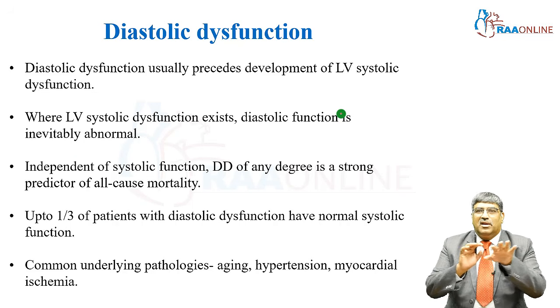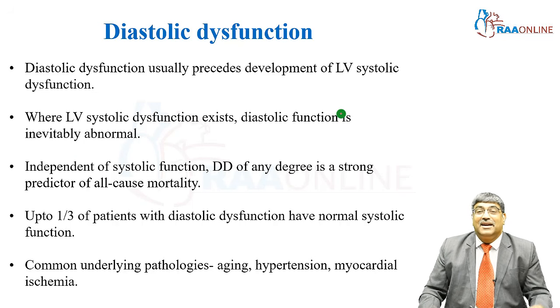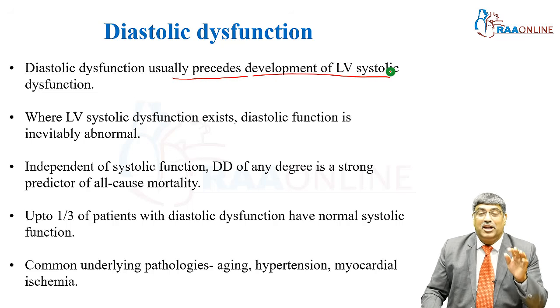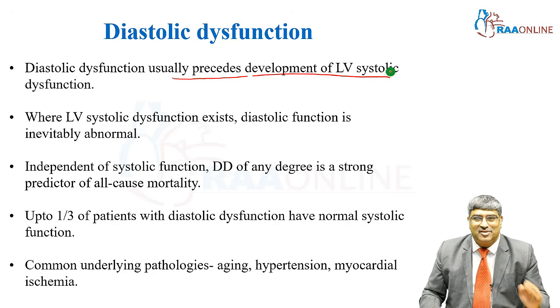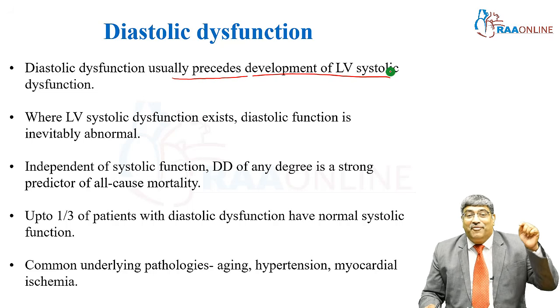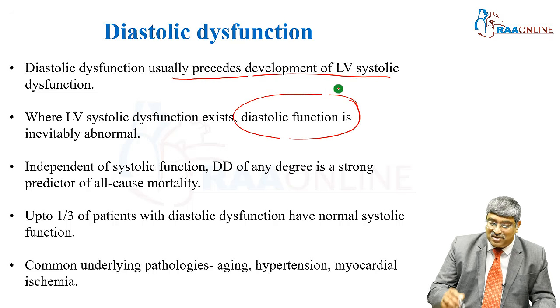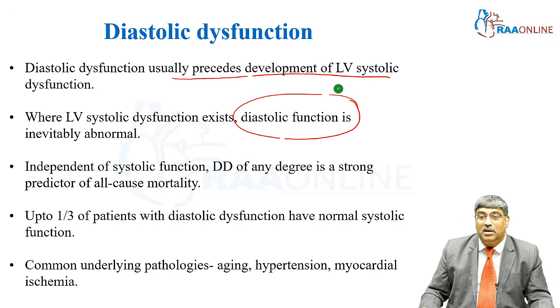Certain points about diastolic function. Diastolic dysfunction usually precedes the development of left ventricular systolic dysfunction, and whenever LV systolic dysfunction exists, the diastolic function is already abnormal.